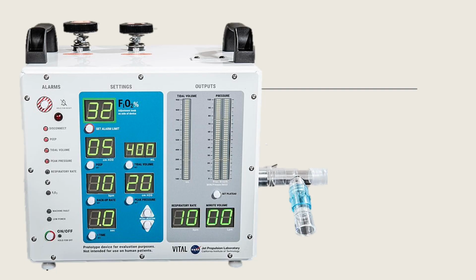How much oxygen you would provide is something called FiO2. Usually inspired oxygen that we breathe from the atmosphere is 21%. However, obviously this 21% would not be enough for someone with respiratory failure. And so typically we provide 100% oxygen for patients with ARDS.